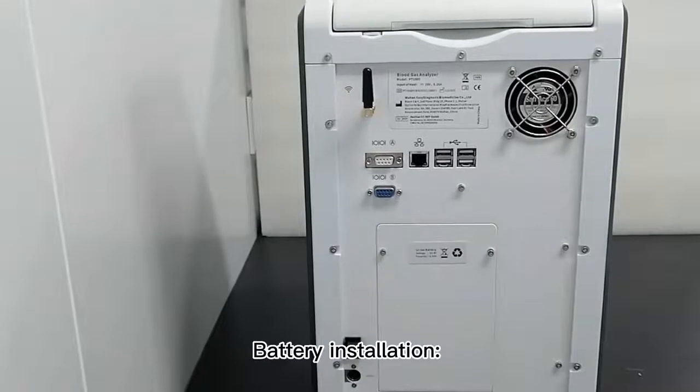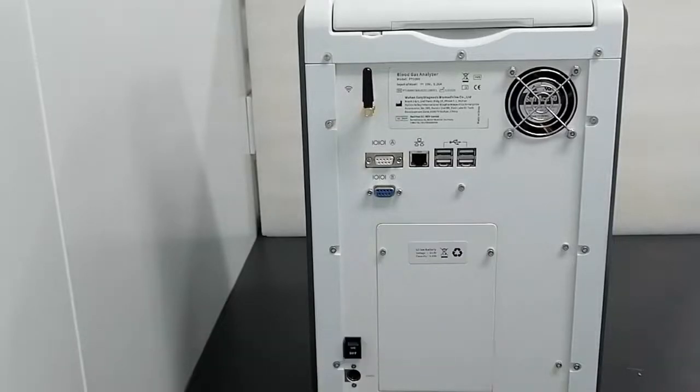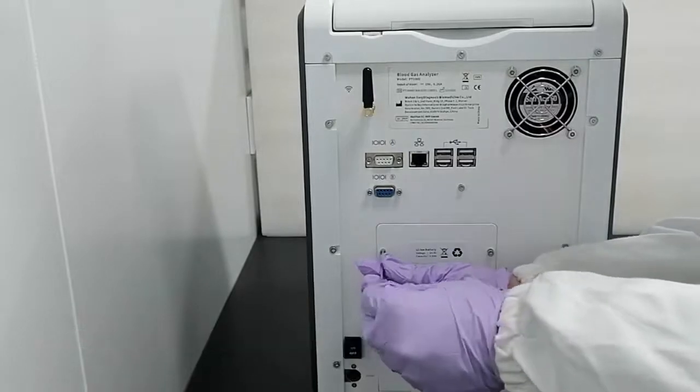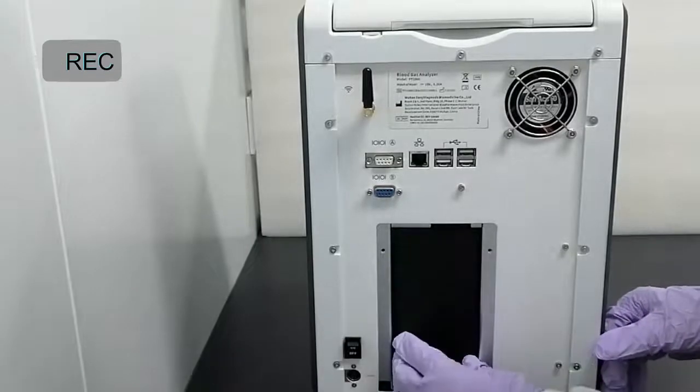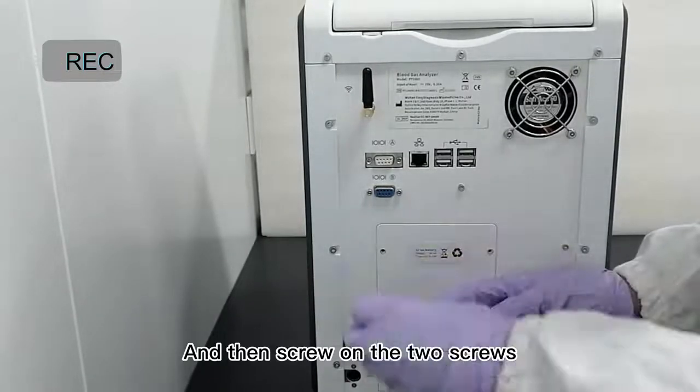Battery installation: place the instrument with its back on a flat table padded with a protective pad. Then remove the two screws to open the battery door and load the battery, and then screw on the two screws.